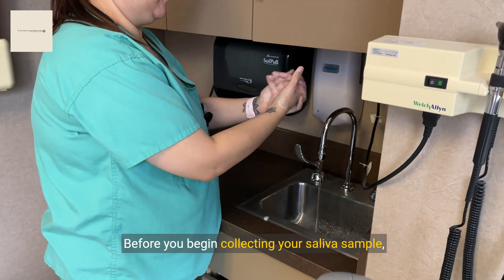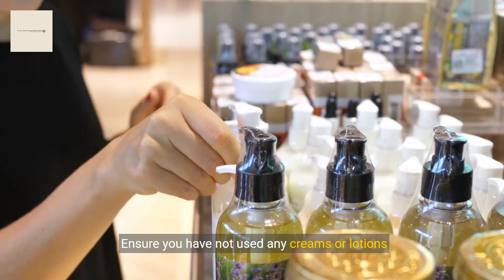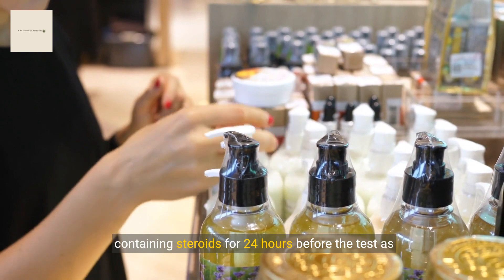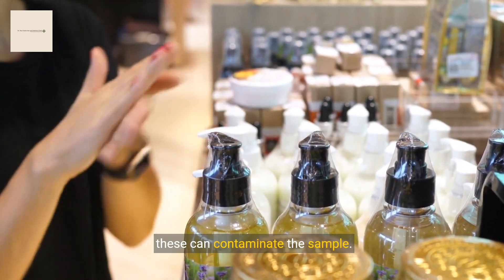Before you begin collecting your saliva sample, please wash your hands thoroughly with soap and water. Ensure you have not used any creams or lotions containing steroids for 24 hours before the test, as these can contaminate the sample.